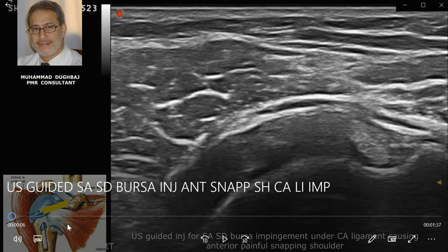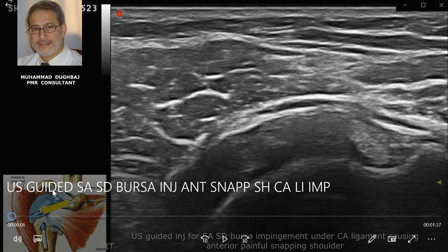The subscapularis bursa, which is deep to the subscapularis tendon, can also cause snapping anterior shoulder. Another cause — which is the case today — is subacromial subdeltoid bursa bursitis with synovial hypertrophy causing impingement under the coracoacromial ligament during internal and external rotation, and with abduction and flexion of the shoulder, bringing the synovial hypertrophy and villous tissue under the coracoacromial ligament during flexion.